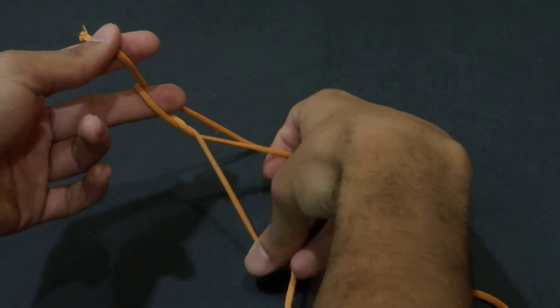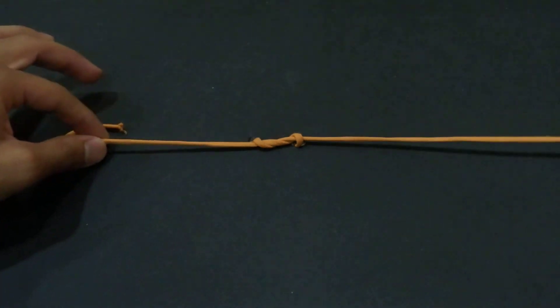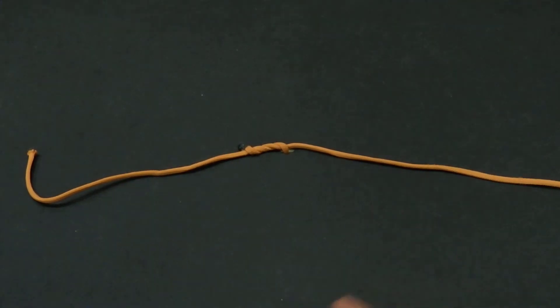So I will go from below and bring it out — here is out and here out. This is the surgeon knot using the single hand technique; one was done by the left hand and the other one was done by the right hand.